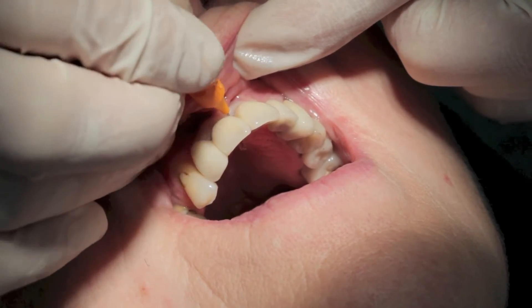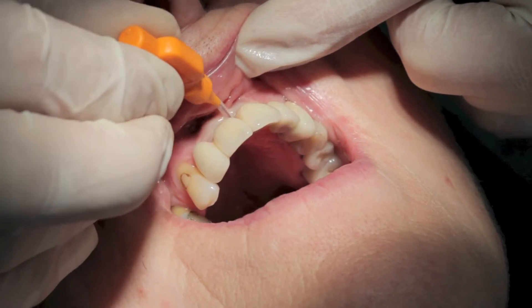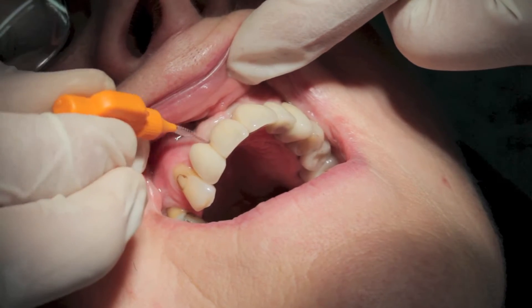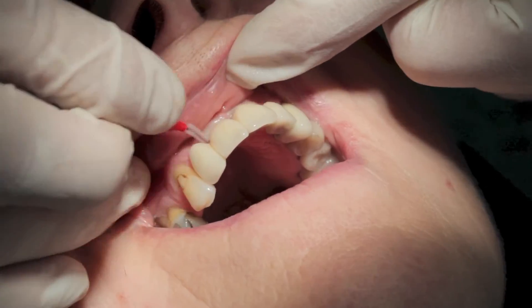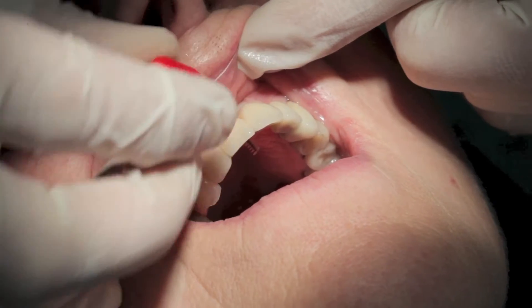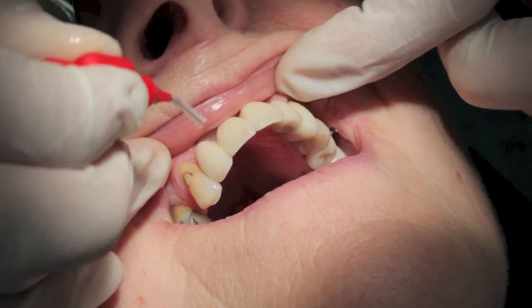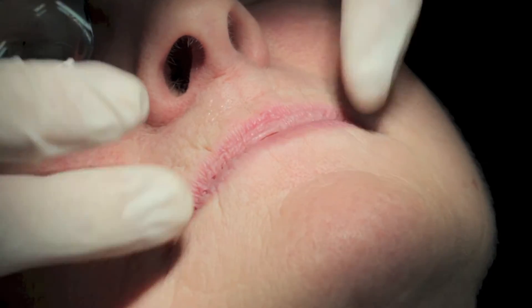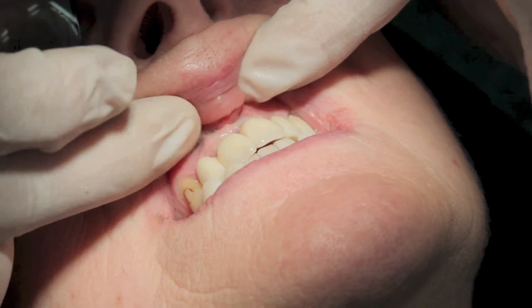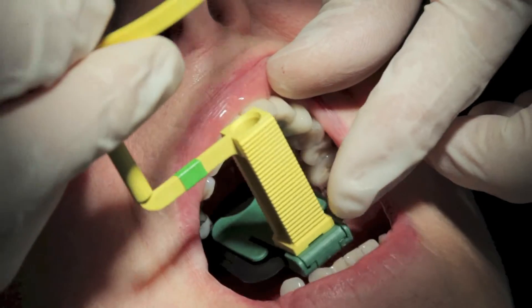I think we'll certainly stick with the orange teepee brush — I'll send you off with a bag of orange ones. I don't want to make it any larger than that. The gaps either side would take a larger brush. Oh, I might even take a red one there now — how's that feel? There we go. And I'm now going to take a check X-ray to be sure that the bridgework is seating nicely onto the implants themselves.